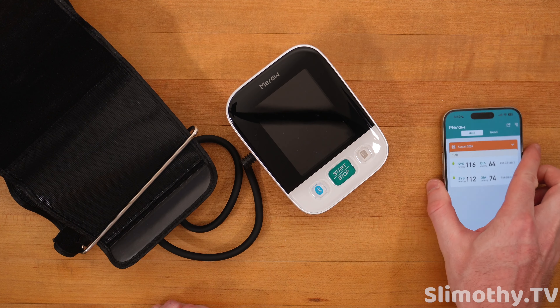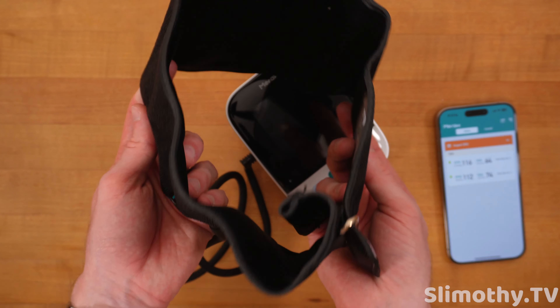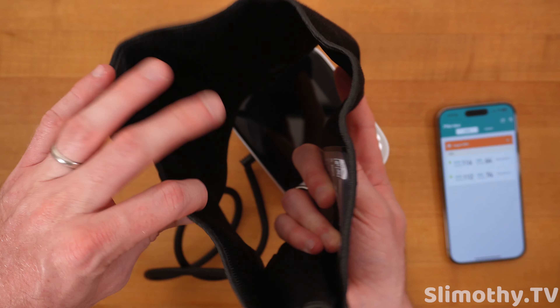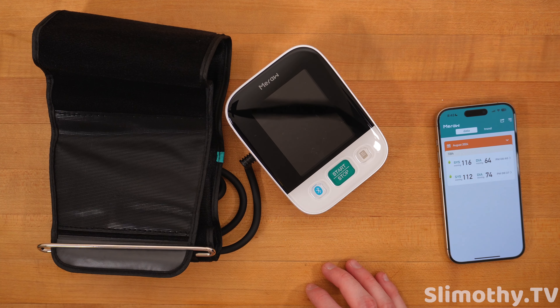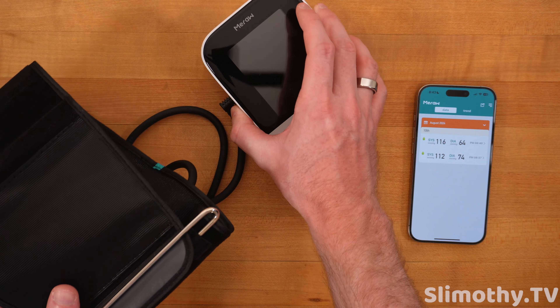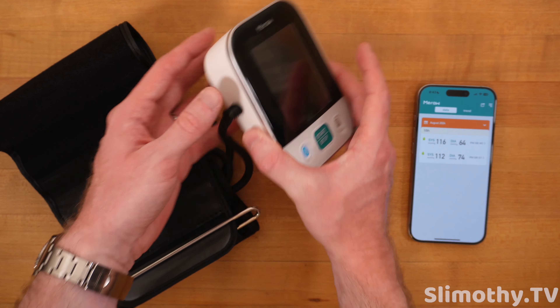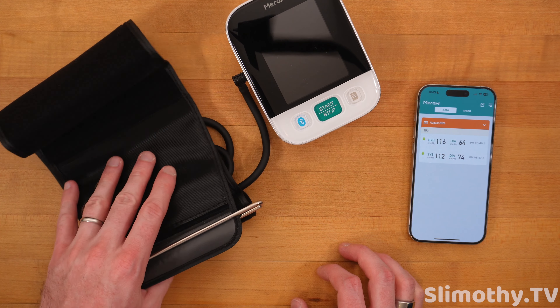A common question is about cuff size. It's very large and easily got around my arm — it can tighten down to pretty much any arm size. If your arm is much bigger, you might have bigger problems than blood pressure. Size should not be an issue for most people. I really like that you can just set it on your desk and do it once in the morning.